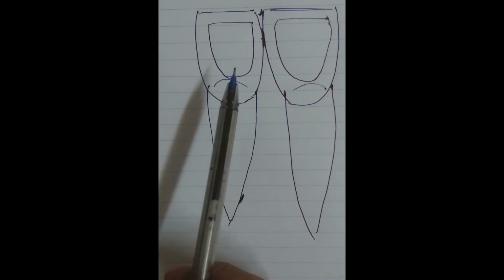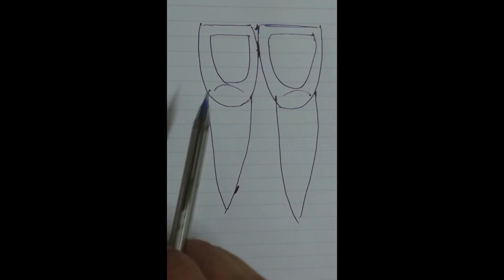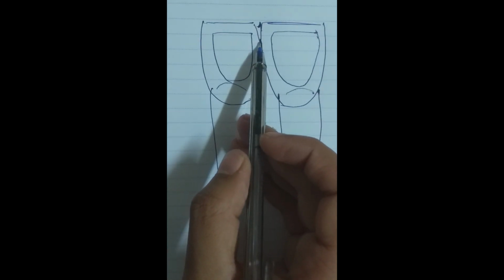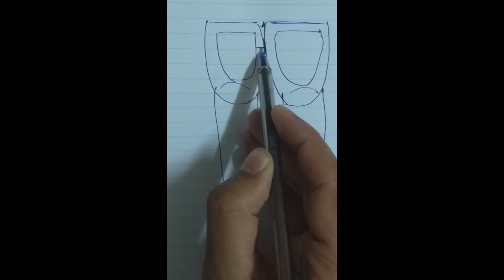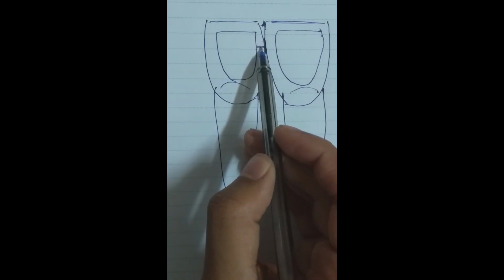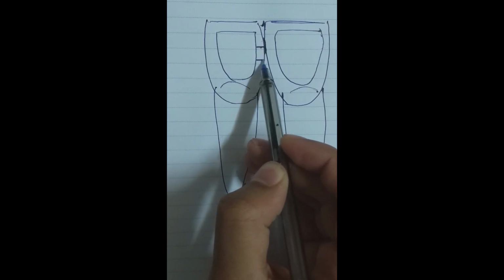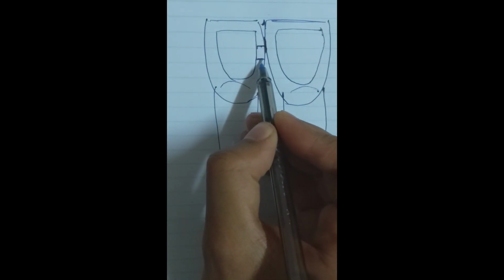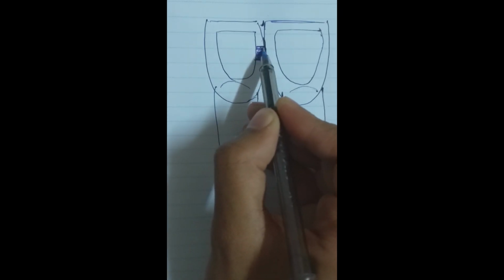We will start our incisal wall of the preparation from the half distance of this contact here, and beneath it 2 milli. The gingival wall will be here. This is our outline from the lingual side.